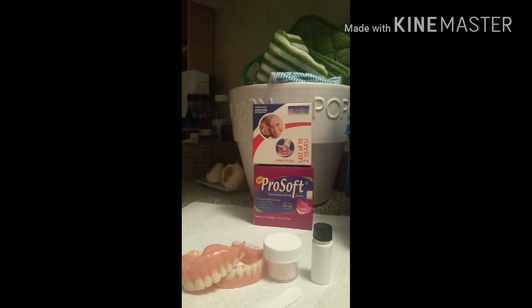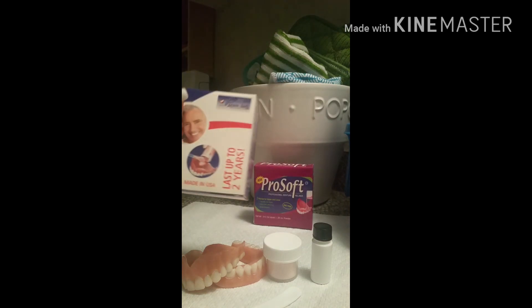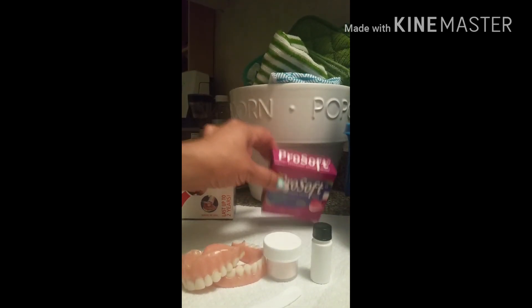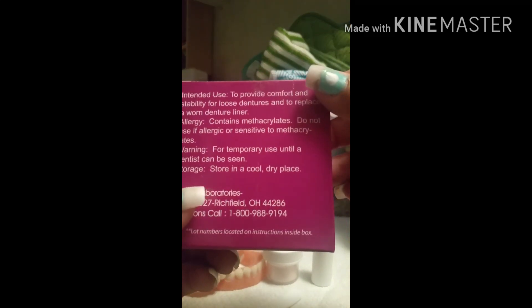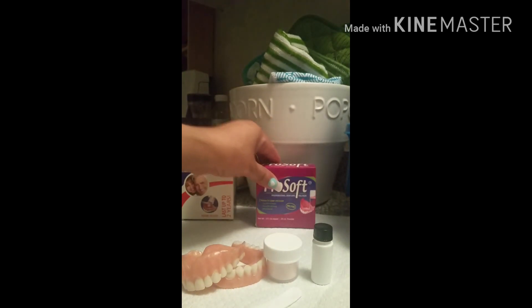I did ask Melissa what the difference was between the two products. She said the Permasoft is a more firm reline — it stays in the denture up to two years. The ProSoft is softer and more flexible, lasts up to three months, and is easier to remove.